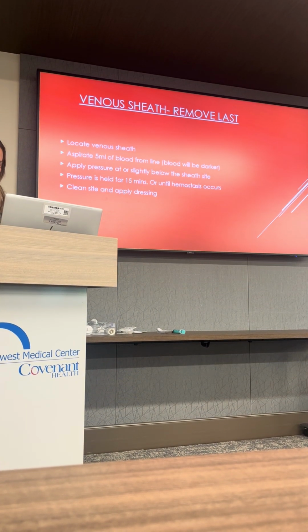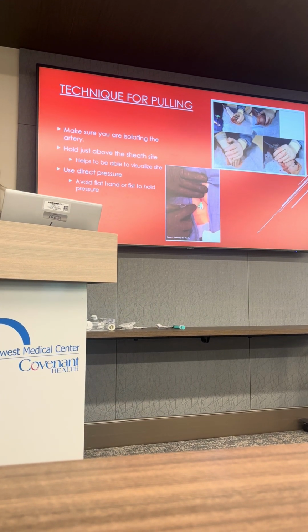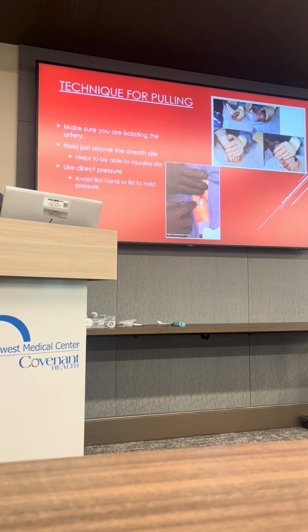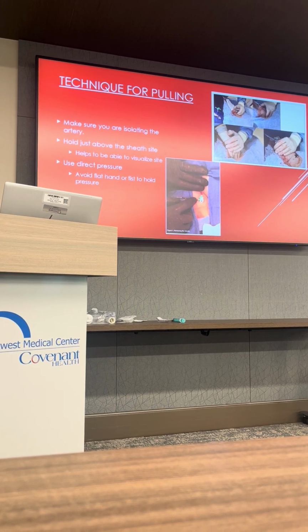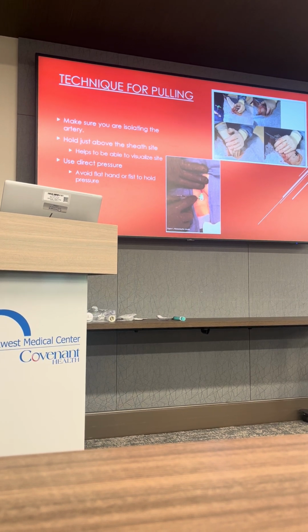Go back to that one point. I think that's a really important point. When we stick a vessel, the deeper the groin, the higher up the vessel is from the entry site of the sheath. In really skinny people with very shallow groins, where we go into the vessel will be closer to where the sheath is.